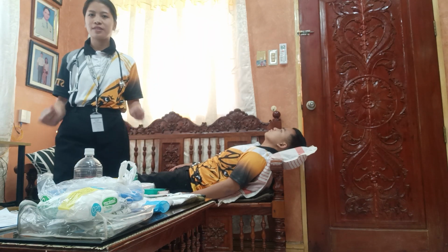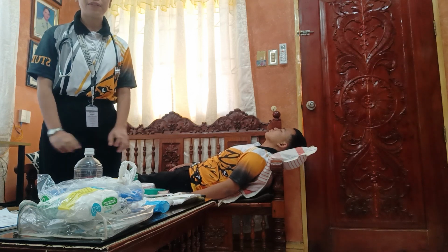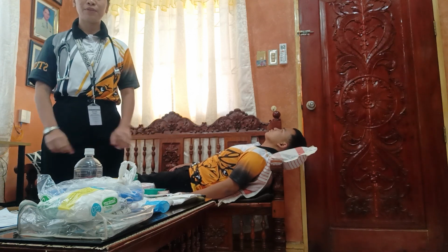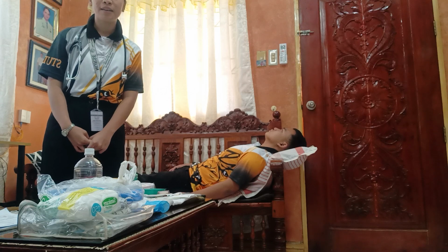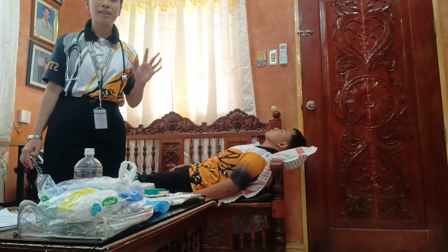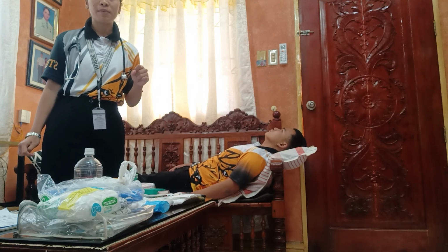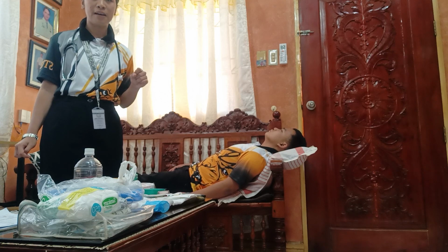patient's nostril, extending to the tip of the earlobe, and then to the tip of the xiphoid process. Mark the tube with an indelible marker. So, measurement po is to ensure that the tube will be long enough to enter the patient's stomach.